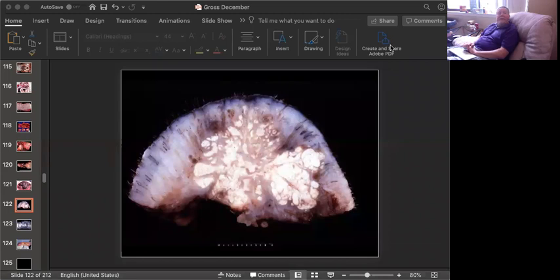Okay, time's up on this one. This is a section probably from the pressure point of an animal, maybe the elbow or something like that. And it's probably a young animal, or it might be an area where there was surgery before. There's been trauma here. And some animals, particularly large breeds, will put down a lot of calcium in and around this area. This is a form of dystrophic calcification. And when you get this much calcium, you often have a granulomatous response. So these are lakes of mineral surrounded by multinucleated giant cells. And the condition is known as calcinosis circumscripta.